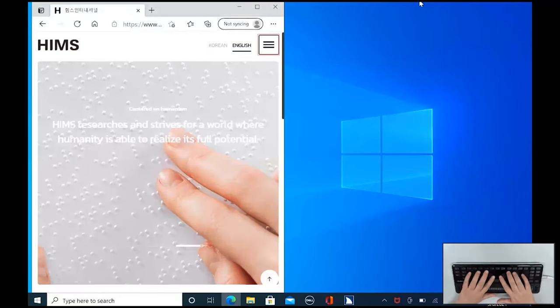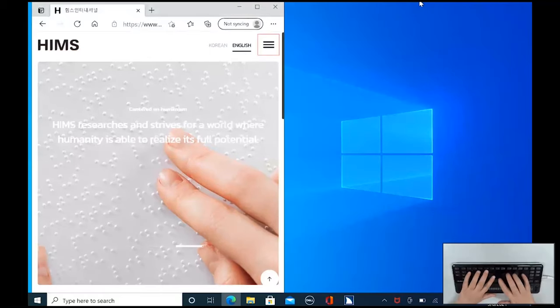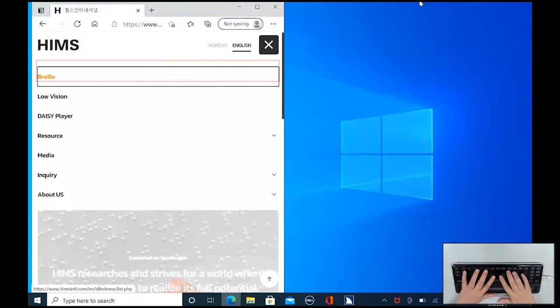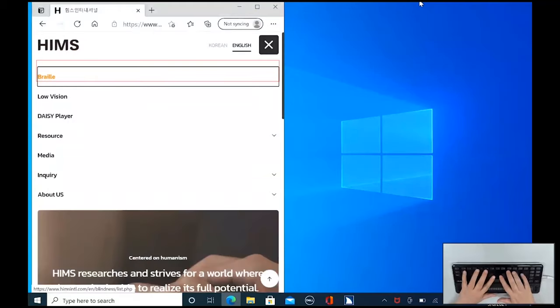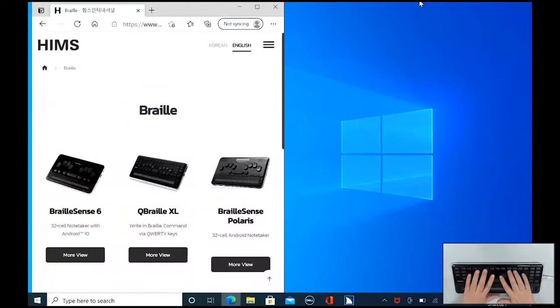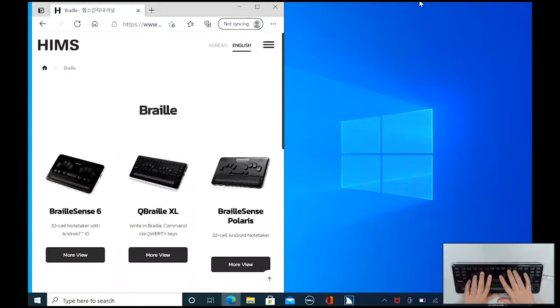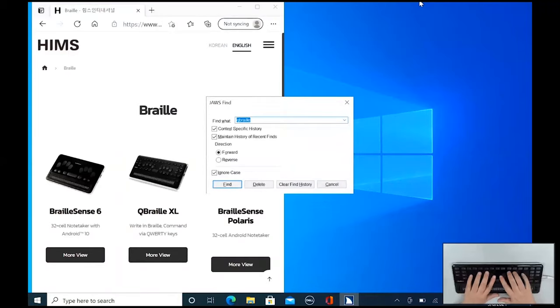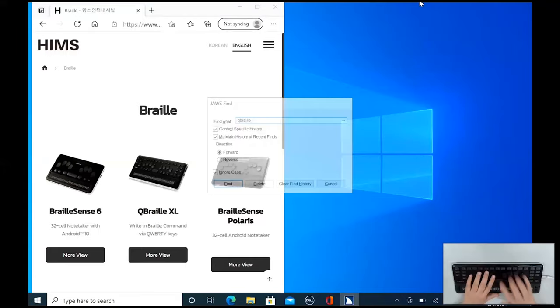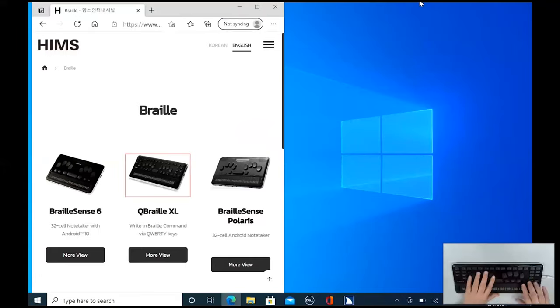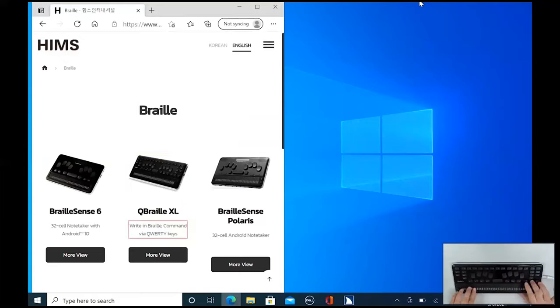Now I'm going to type control F as I normally would in JAWS to find. And I've been there before too. So we'll press enter. So now we have the image and I can just arrow down to see what we've got here. Q Braille XL. Write in Braille. Command via QWERTY keys. All right. More view. And we'll press enter here. Okay. And this time I want to jump to the Q Braille. So I'll use H to jump by heading. And here we go. And once again, I'll use my arrow keys.